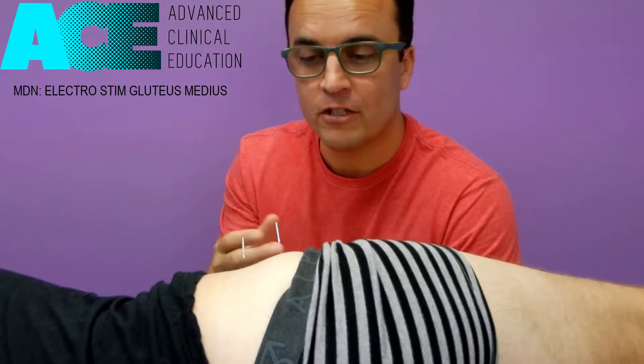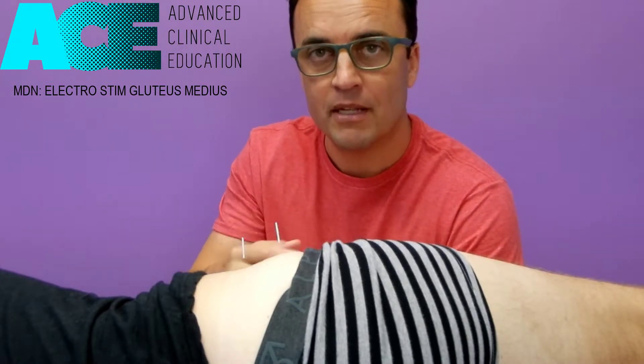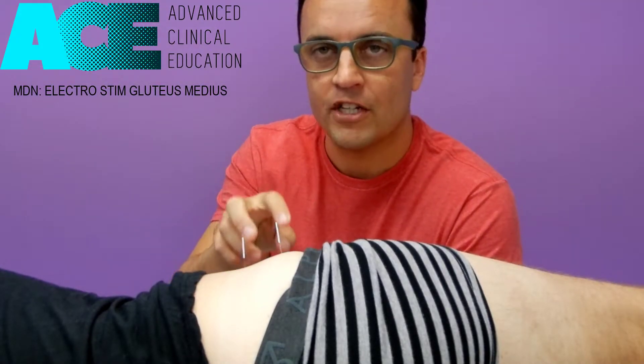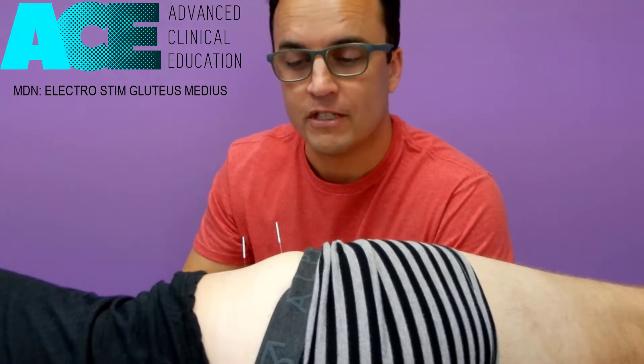Why was the glute med inactive in the first place? It may have had trigger points, it may have been excessively fatigued for whatever reason. But if we treat those trigger points with dry needling we deactivate them, and if we couple that with some electro stim we can start to fire up some of the motor units within that muscle to help not only with the deactivation of the trigger points but the reactivation of the muscle to get it firing well and start to decrease some of that dominance of the TFL.